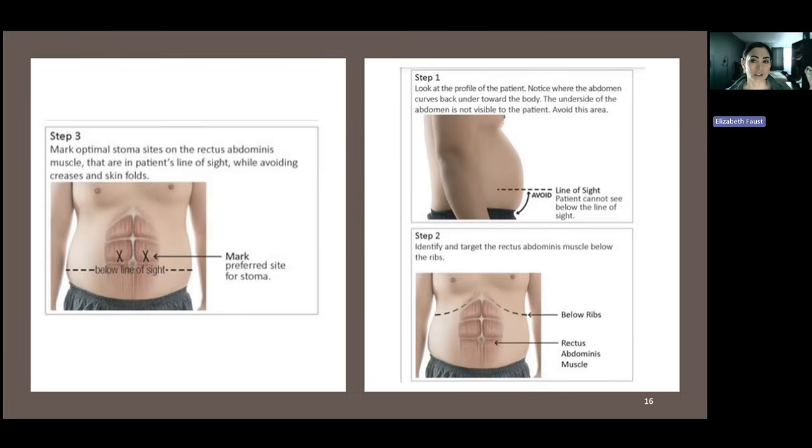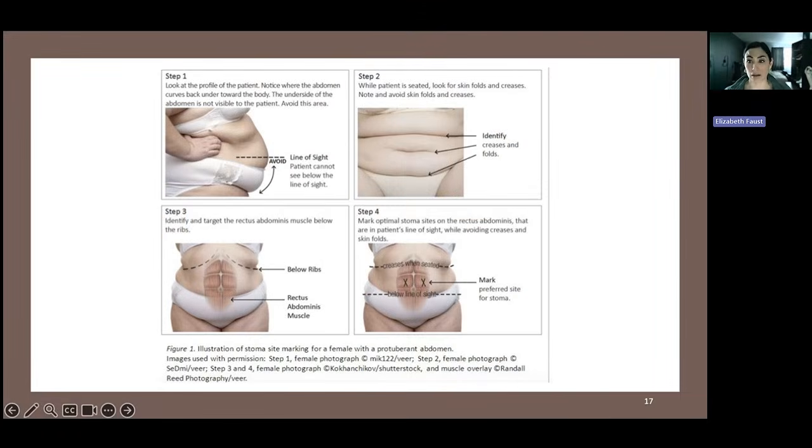And one of the challenges is that often surgeons are seeing the patient's full anatomy only when they're lying on the OR table, and they may not see all the things such as these folds that you can see here. So really ensuring that you know the anatomy of your patient, but there can be signs.